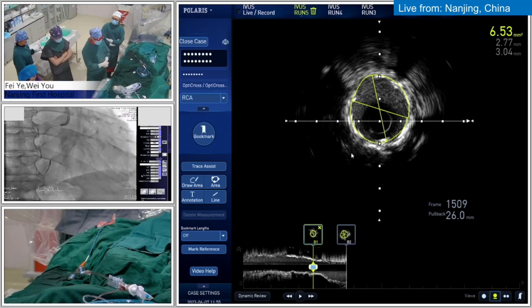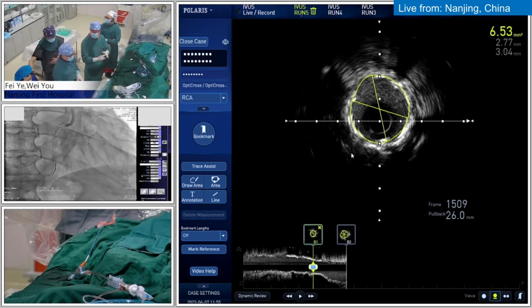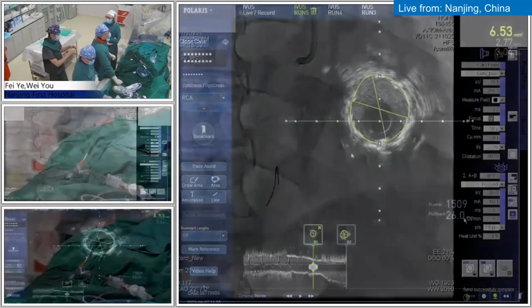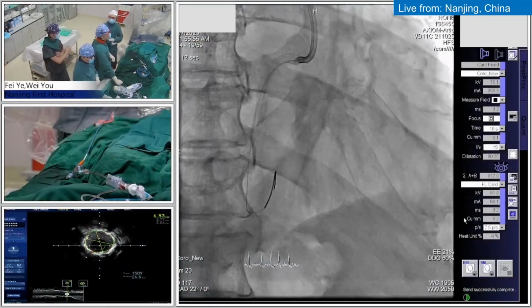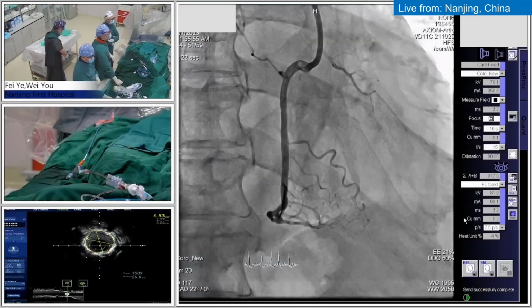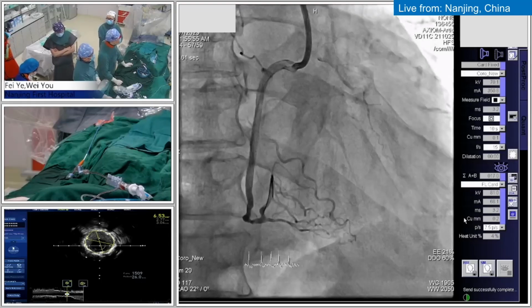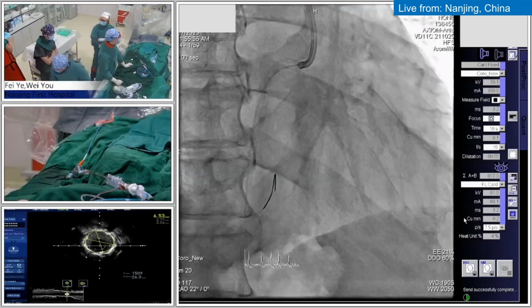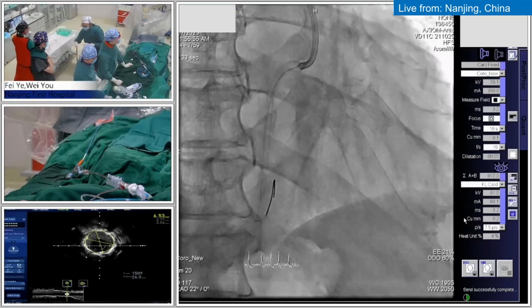If there is a polymer with integrity on the stent here, and it is only a newer stent we put into the vessel, we will destroy the polymer and the drug of the stent. So we don't know the future outcome after we use IVL in this kind of situation. Sometimes we use it for post-dilation.